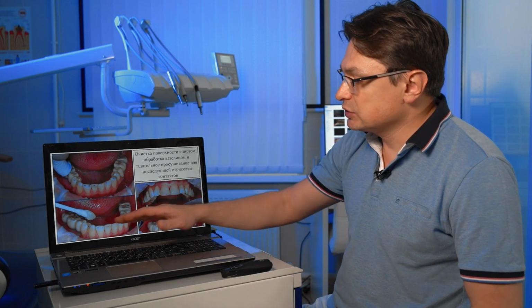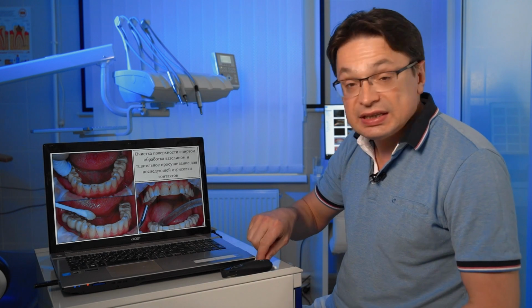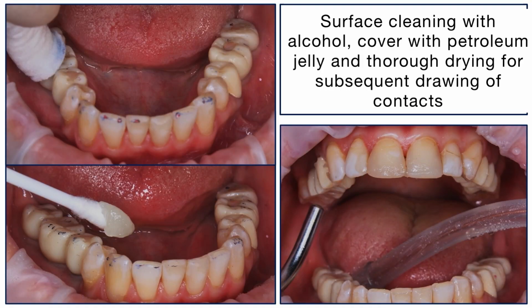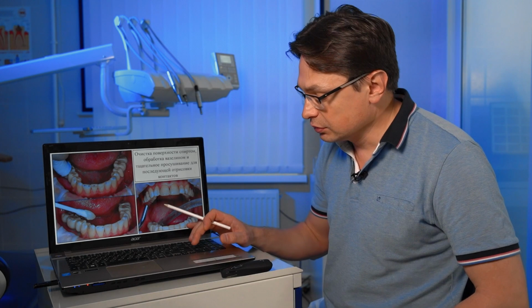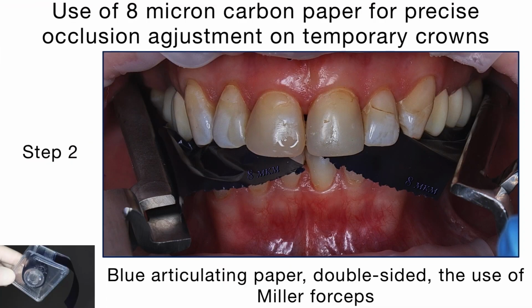After all, we clear everything, look, check contacts. Sometimes I use Vaseline so that I can clearly see the contact. In general, in dentistry, it is very difficult to work without Vaseline, duct tape, super glue and a hammer, but one can. And then our next step.